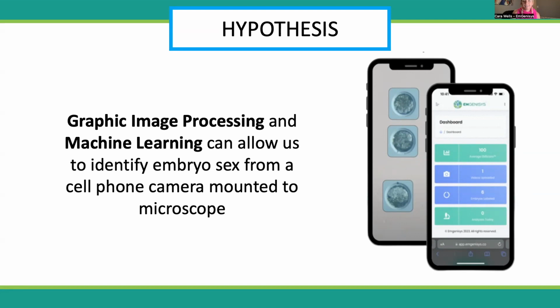Therefore, our team decided to take a different approach to predict and identify embryo sex. In recent years, there have been major advancements in camera and computing technologies. We suspected that cameras could capture growth and developmental characteristics that are not perceptible to the human eye and brain when examining the embryos under a microscope.